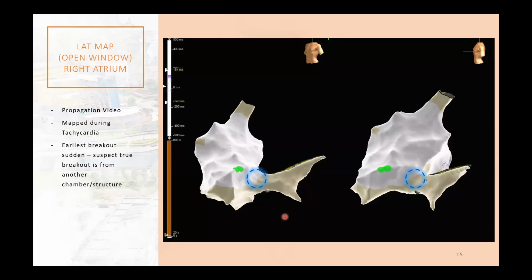But to differentiate fusion between septal activation and pathway activation, you must put the RV catheter right at the posterior septum and pace from there. Then you map. That will differentiate your pathway potential far better than septal pacing. This is the message you can take home today. So the golden rule: pace closest to the pathway insertion site, whether atrium or ventricle doesn't matter. Move the catheter, then constantly pace from there. You create a map, and then you guide the ablation. That will help you.